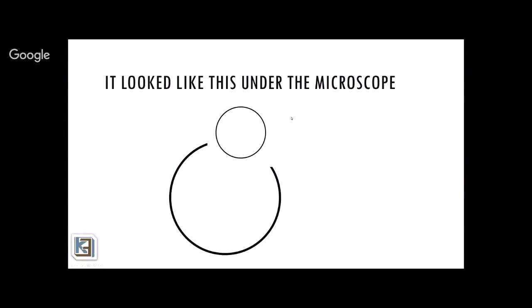And that's when I decided, Robox and 100 microns are not good enough for this. We have to look for something more accurate, that can print to a higher accuracy, and we can go down to 50 or 20 microns. And that's when we stumbled on the Moonray, and we started using it in dentistry.